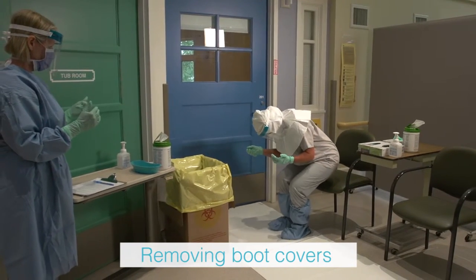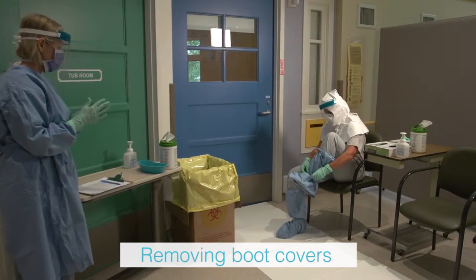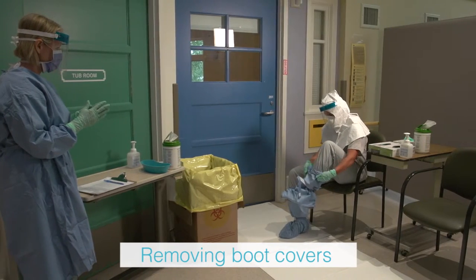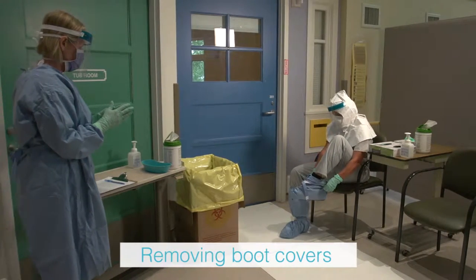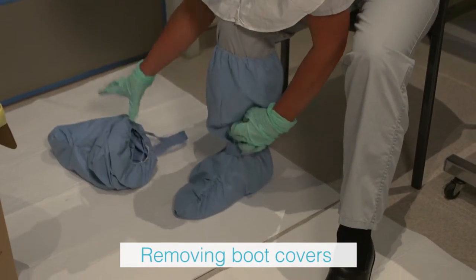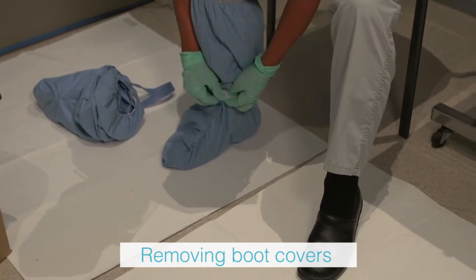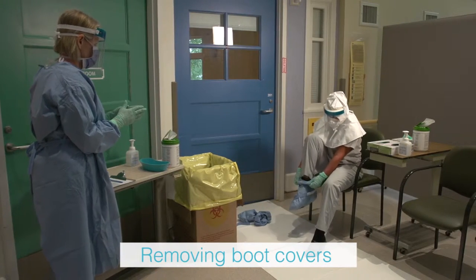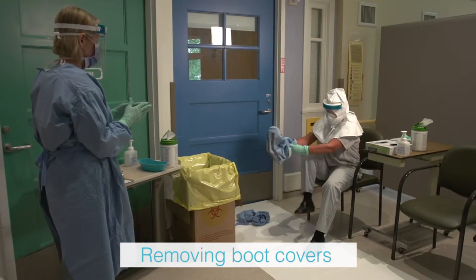The health care provider sits on a clean chair and removes the knee-high boot covers one at a time by rolling down and outward, lifting the heel first and then the toes. Step out of the boot covers one at a time onto the second doffing pad, starting with the foot closest to the second doffing mat. Boot covers can be left on the first doffing pad to be discarded later.